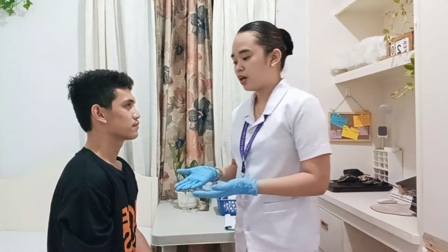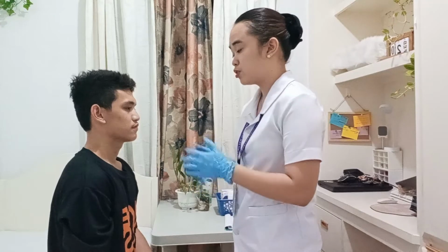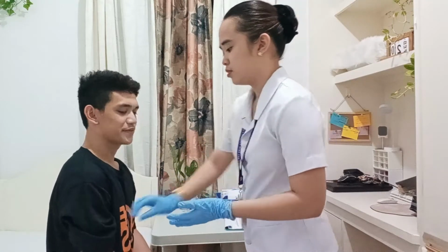Now I'm going to perform the axillary method of obtaining body temperature. So the first thing we need to do is to move the sleeve of our patient away from his torso and instruct the patient to raise his arm to inspect for any lesions or any perspiration. Mr. Patrick, is it okay if I move your sleeve for me to assess your body temperature through your armpit? Yes, it's okay. Okay, thank you.